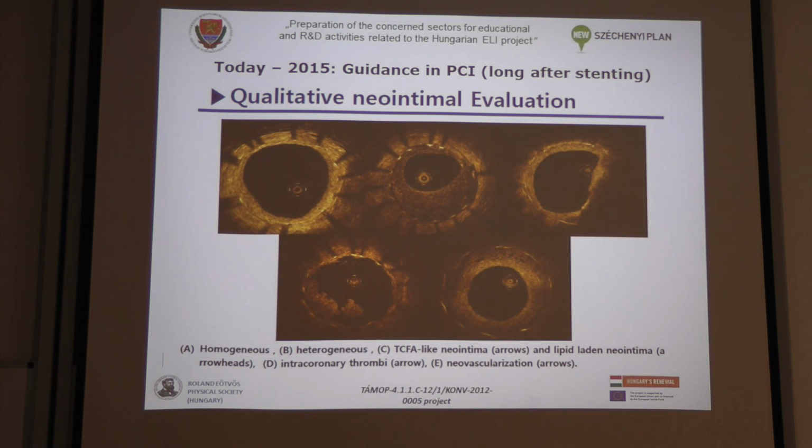And I will show you one patient for today. He received his stent a couple of years ago, and 3 or 4 months ago we did the angiography, and there was a certain borderline restenosis within his stent on angio.